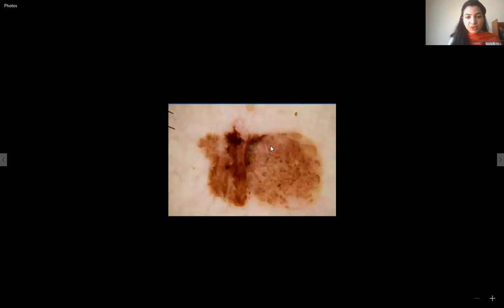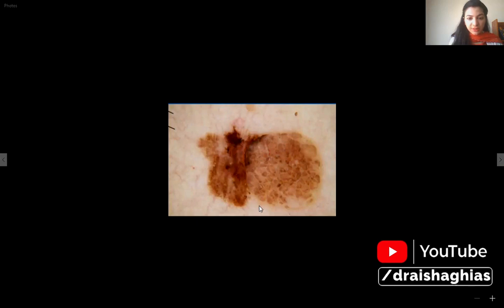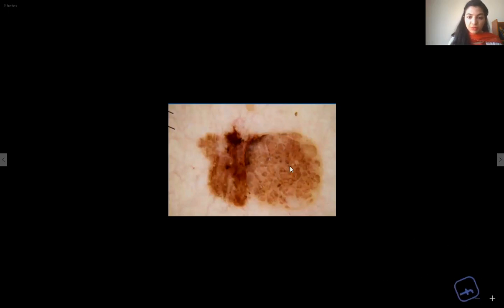This was another quiz image. As you can see, there is a globular nevus — the dark brown clods — which is basically an intradermal nevus. Adjoining the nevus you see color variegation from light to dark brown, a peripheral structureless area, radial lines in the periphery, and isolated dots and clods. This one is a melanoma arising from a globular intradermal nevus.